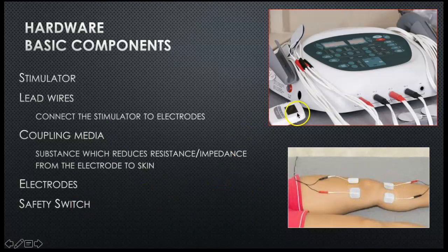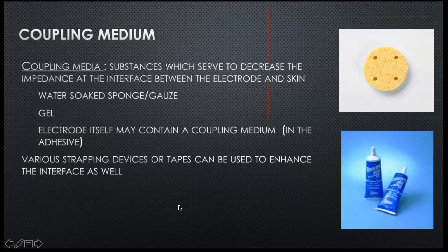And then there's a safety switch often with a lot of units. So you set your patient up on it, and you can go and do something else, and they have the ability to turn it off in case something goes wrong or they're uncomfortable.